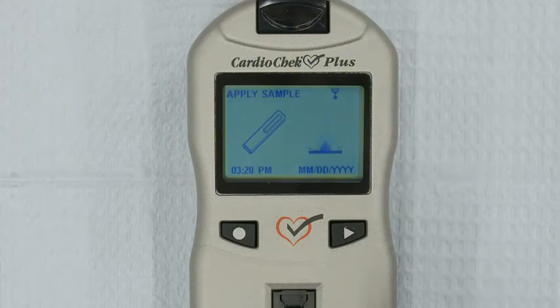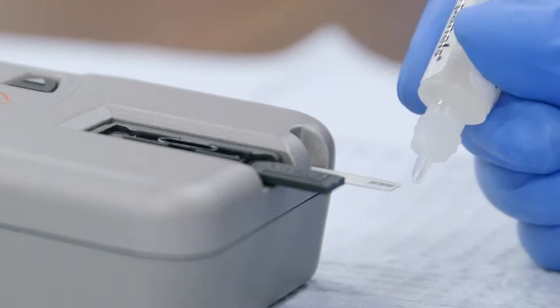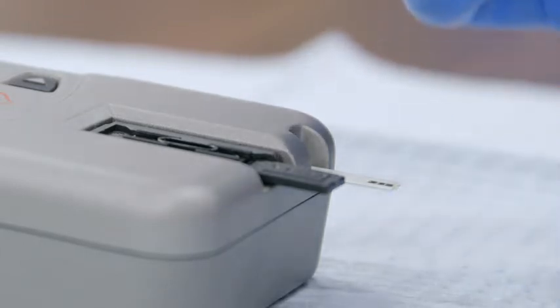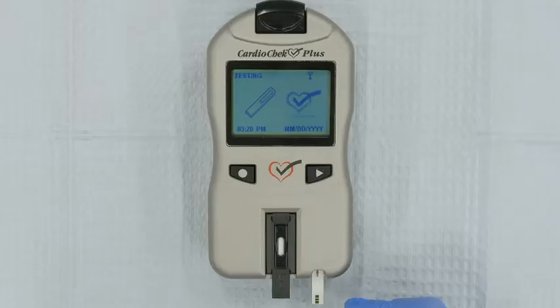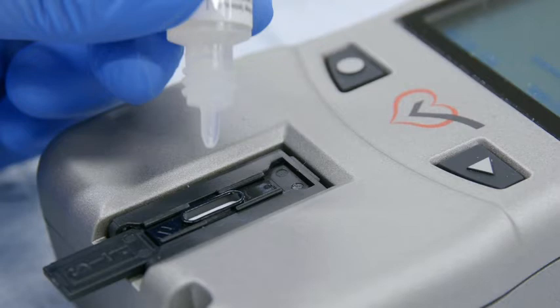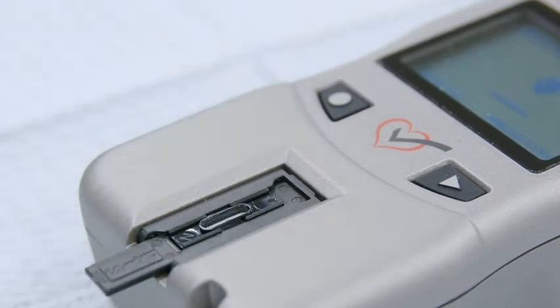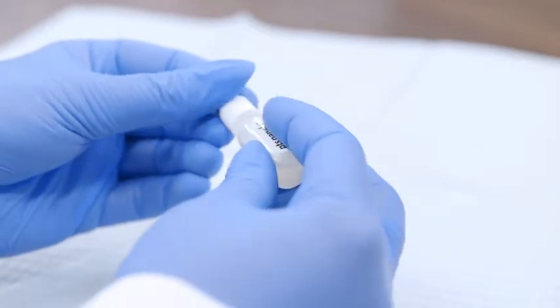Start by inverting the level one control vial four to six times to mix the solution. Then remove the cap, turn the vial upside down, and hold the tip of the vial directly in front of the tip of the eGlue test strip. Do not touch the vial to the strip. Carefully squeeze the vial to deliver one drop of control solution to the tip of the electrochemical test strip. Next, apply solution to the lipid panel test strip. Turn the level one control vial upside down and hover the tip directly above the test strip blood application window. Do not touch the test strip with the vial. Carefully squeeze the vial to deliver two drops of control solution to the blood application window. Replace the cap on the vial of control solution.